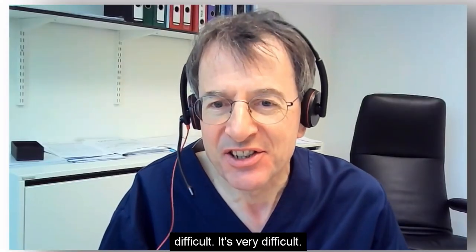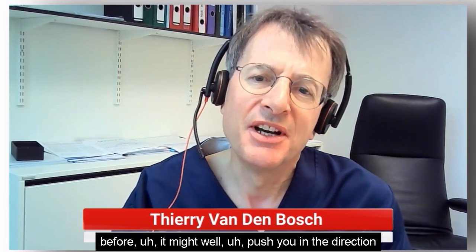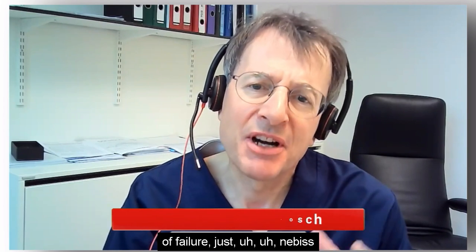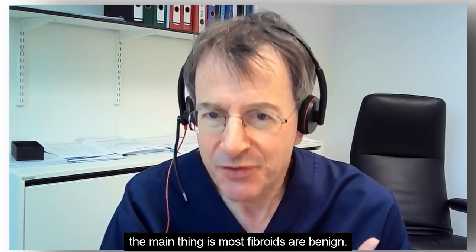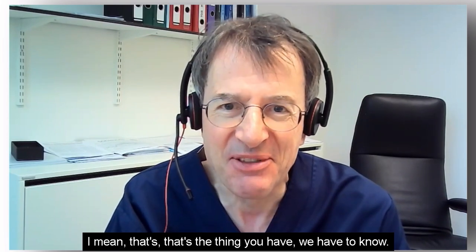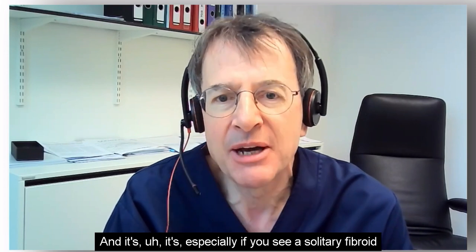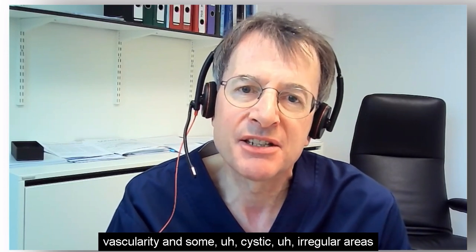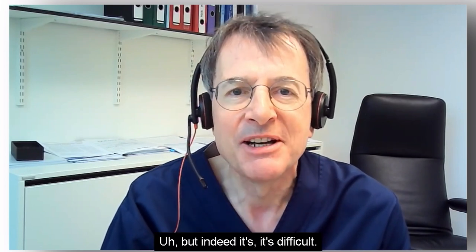Indeed, I mean it's difficult. It's very difficult. Of course, if you have an episode of severe pain before, it might push you in the direction of just a necrobiosis of a fibroid, and that's more reassuring. But the main thing is most fibroids are benign. That's the thing you have to know, and especially if you see a solitary fibroid that's fast growing with chaotic vascularity and some cystic irregular areas inside, you have to be careful, but indeed it's difficult.